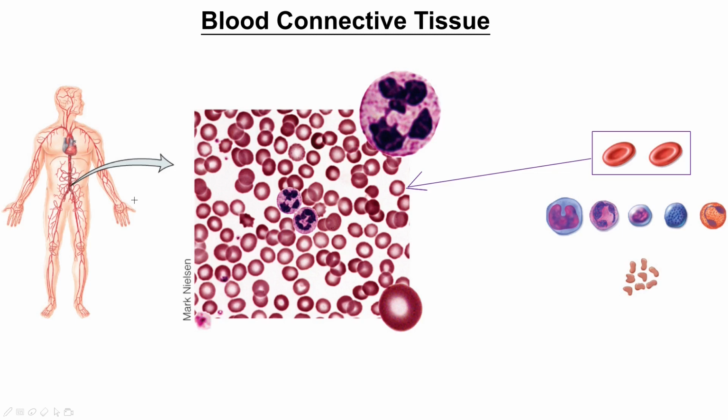This tissue also has white blood cells, otherwise known as leukocytes. There is a great variety of leukocytes present in blood tissue. They are larger than erythrocytes and have variously shaped nuclei according to their type. Platelets are also present as very small fragments with no nuclei.